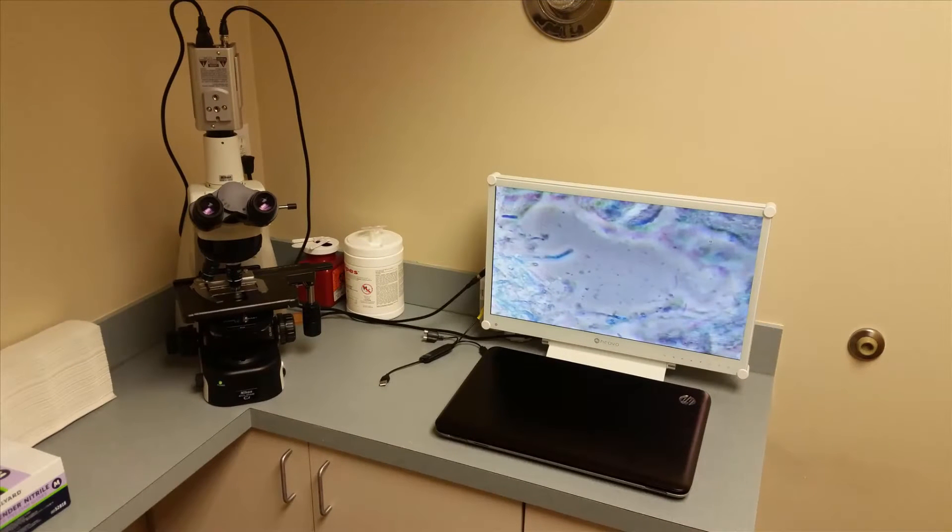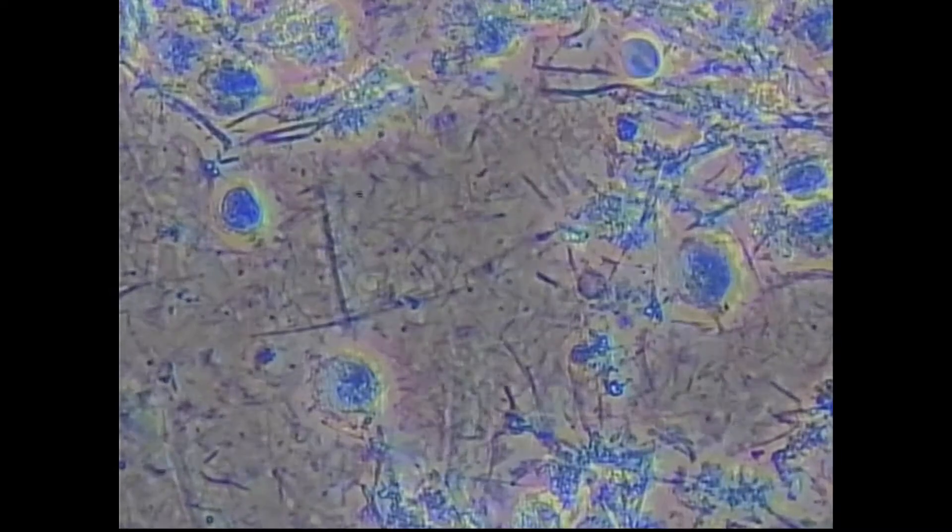In our office, we use phase contrast video microscopy to take plaque samples, and that gives us a better indication of periodontal risk assessment than just a periodontal probe measurement. And so when you do that and you take a plaque sample, this is what we see in his mouth.